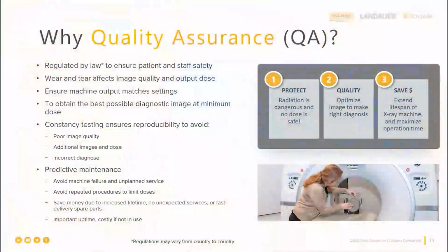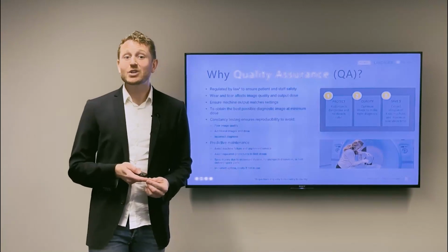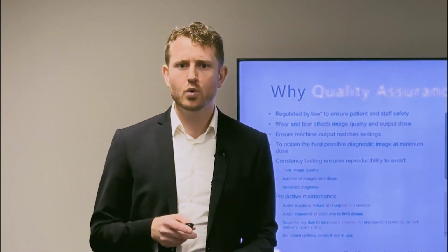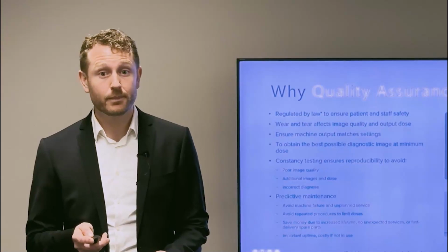But why do we need to do QA measurements? This is mainly driven by regulation to ensure patient and staff safety, but there are also some economical incentives. Malfunctioning of an X-ray machine is not only expensive due to new parts and downtime. Malfunctioning can also lead to increased dose to both patients and staff. And avoiding unnecessary dose should always be top priority if one is working in accordance with ALARA.